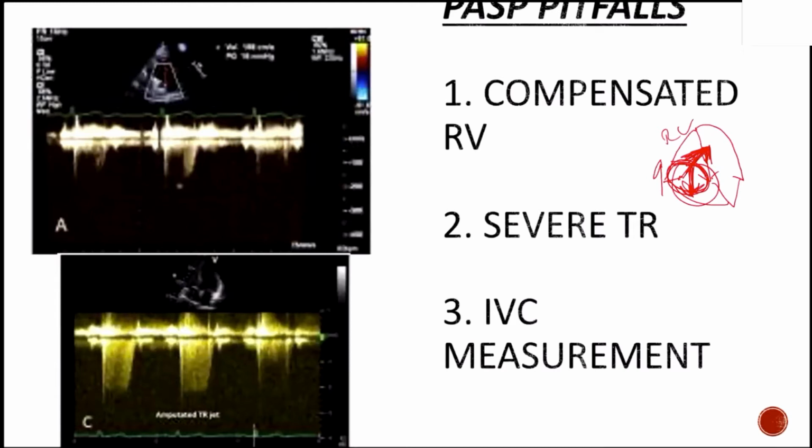All right. If you have somebody who has severe tricuspid regurgitation, you're going to have very quick equilibration in pressures in the two chambers. We've talked about this a lot, that if there's a lot of regurgitation, you are going to reach your velocity fast. It's going to cut off, and then you're going to have a slow recovery backwards. So if you have very severe TR, you may not be able to truly see what your high velocity is, because it's going to cut off really early as the two chambers become equal all of a sudden. And sometimes you have something called ventriculization of the right atrium.